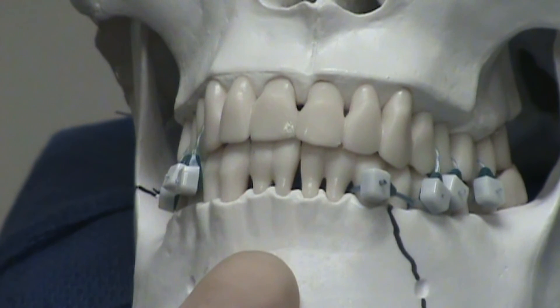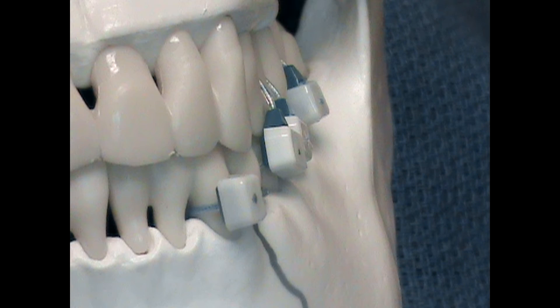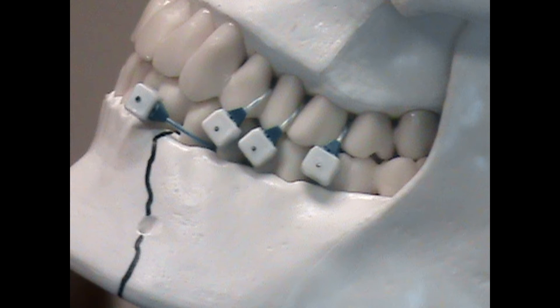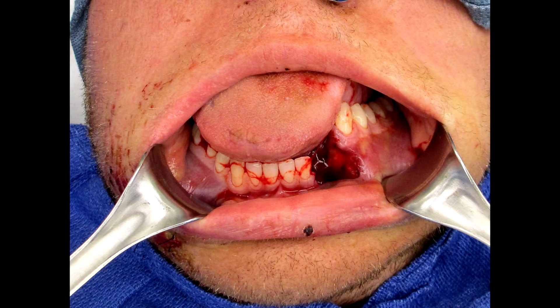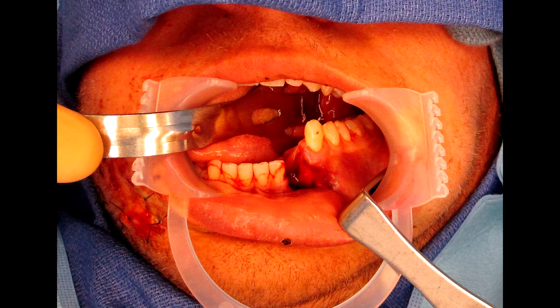The complement of devices have formed a low profile, minimally invasive form of maxillomandibular fixation. Here is an example of a patient who sustained bilateral mandible fractures that were secured using internal fixation as well as mini-ties for maxillomandibular fixation.